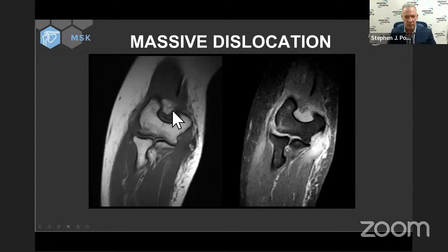You're pretty far anterior, so that's the proper, it's just truncated and cut off. But where is your ulnar collateral ligament anterior band? It's reduced to a pile of dust. That's what's left of it right there. Never makes it to the sublime tubercle. So both of them are torn.